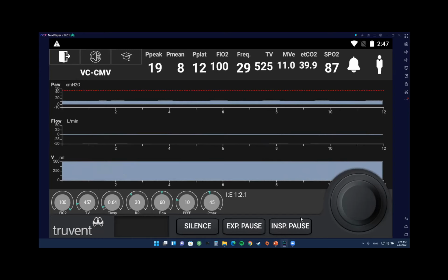It's an expected change. And that's why, usually, when you have a patient that is coming to the unit hypotensive and hypoxic, you have to deal with the blood pressure at the same time, right? You cannot just do a lot of PEEP on that hypoxic, hypotensive patient, because if you do that, the blood pressure will crash because of the PEEP you're giving. So it's going to make the shock worse.